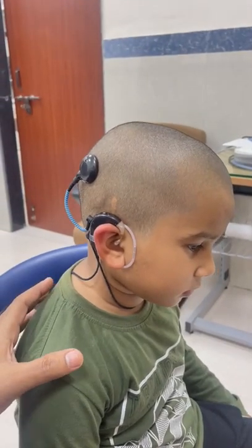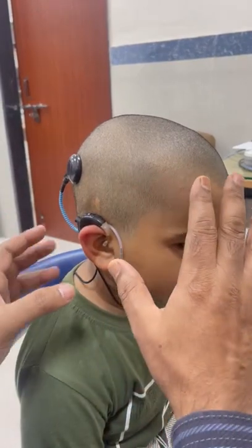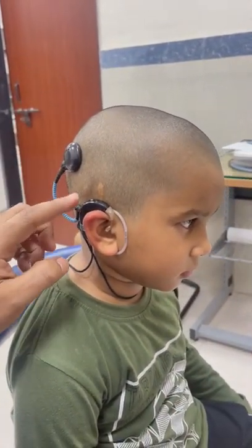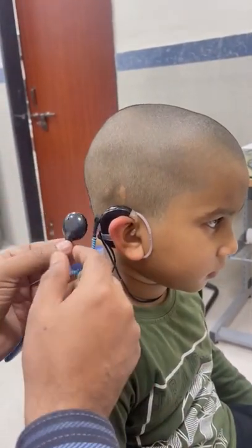This child was operated in the year 2019. Here you can see the speech processor, the transmitter coil, and the speech processor with microphone.